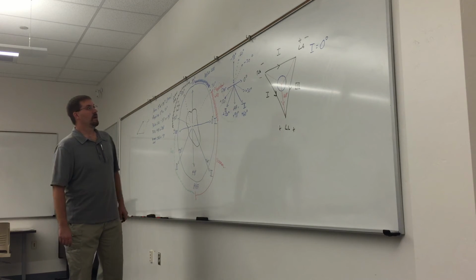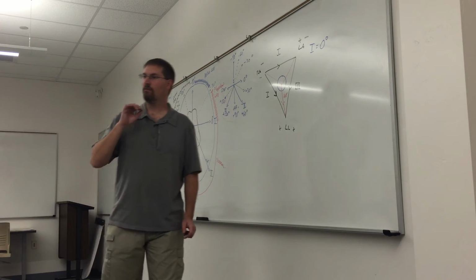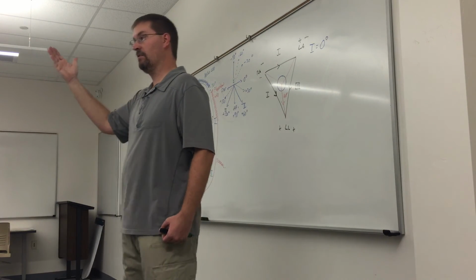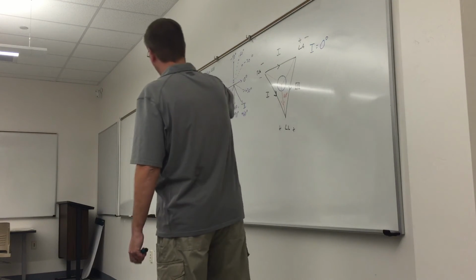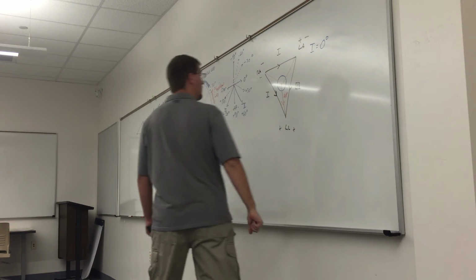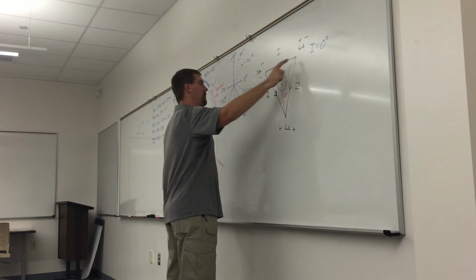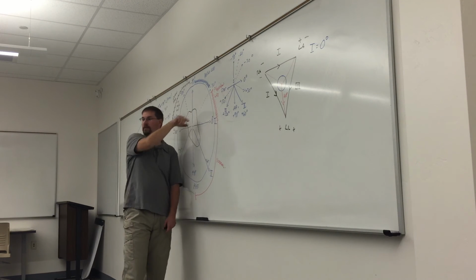Positive. Okay, so now we're going to start putting everything that we've been learning together. If the QRS on the ECG is mostly positive, greater than half of it positive, where is that impulse moving? Is it moving toward or away from the positive electrode? Toward the positive electrode. Are you guys cool with that? So what are my electrodes for lead 1? Negative to positive. So if it's positive, that means it's moving toward lead 1. Are you guys cool with that? It's moving toward lead 1.